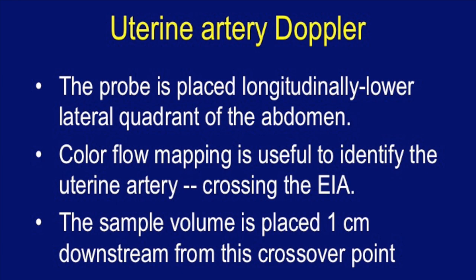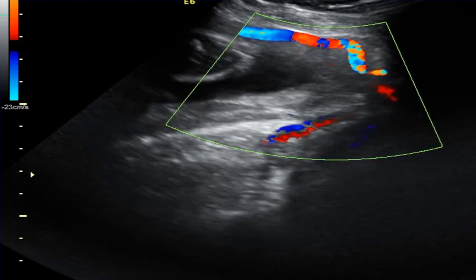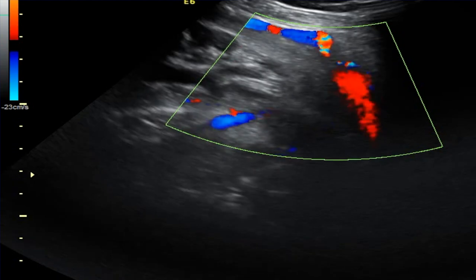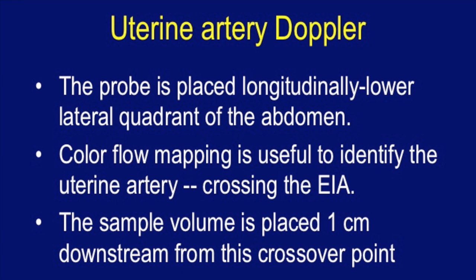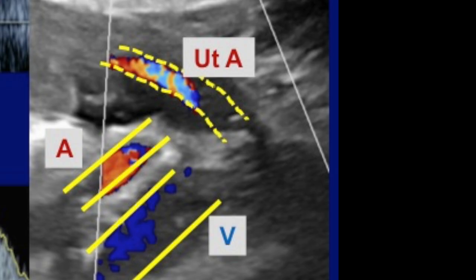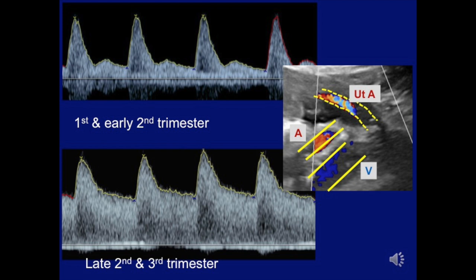For uterine artery Doppler, place the probe longitudinally in the lower lateral quadrant. Color flow mapping identifies the uterine artery as it crosses over the iliac artery, and the sample volume is placed one centimeter downstream from this crossover point. There is a very high forward diastolic flow in the third trimester, and PI greater than the 95th percentile is abnormal.